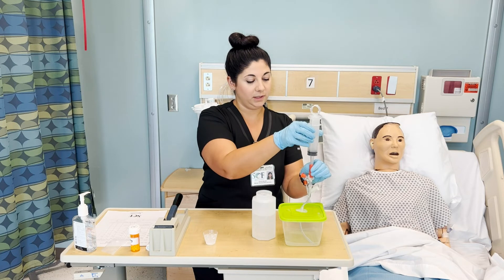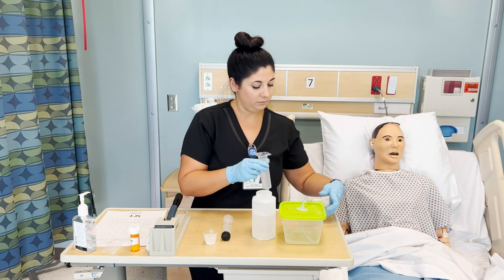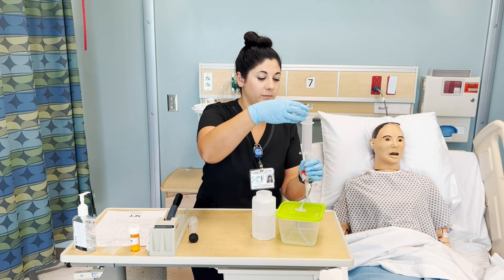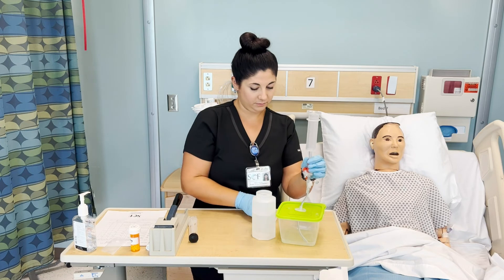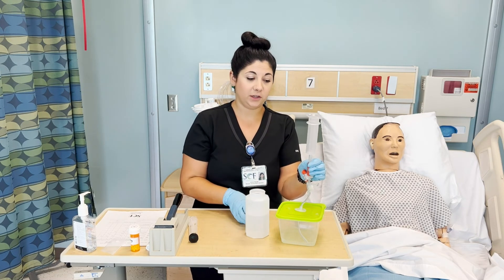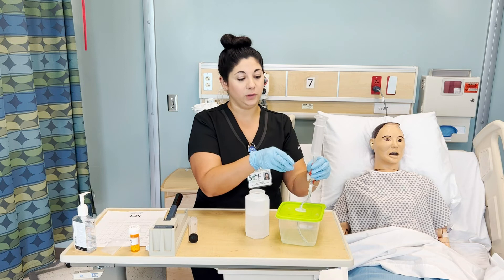Once that's in, we can take this off. I'm going to remove this plunger, opening that up, and we can just pour our medication right in. It should go in easily by gravity. And then you'll flush with about 20 milliliters after. If you have several medications that you're giving, make sure you are mixing each one separately and flushing with 20 to 30 milliliters of fluid in between. And you are keeping track of the intake so that you can record that.